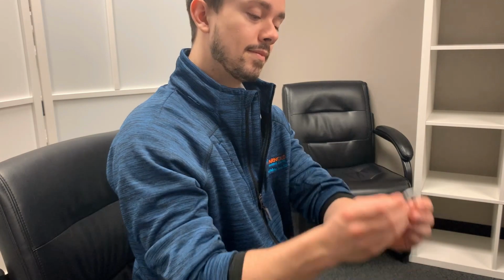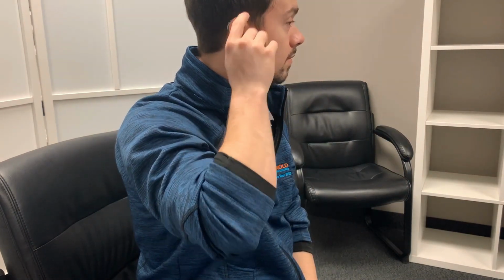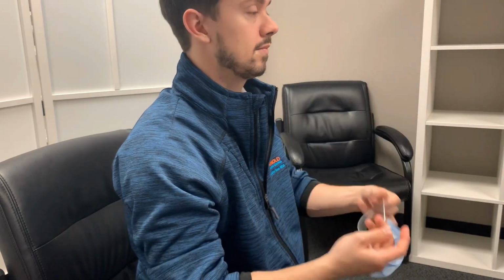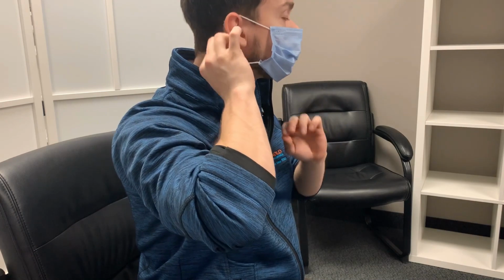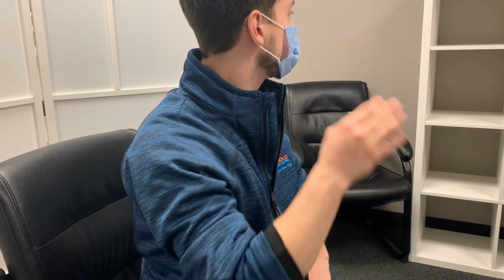First, you are going to put the hearing aid on. This will allow the aid to be tight against the ear. Next, you will put the mask on. Now the mask should be right after, so it should be your head, the hearing aid, and then the mask.